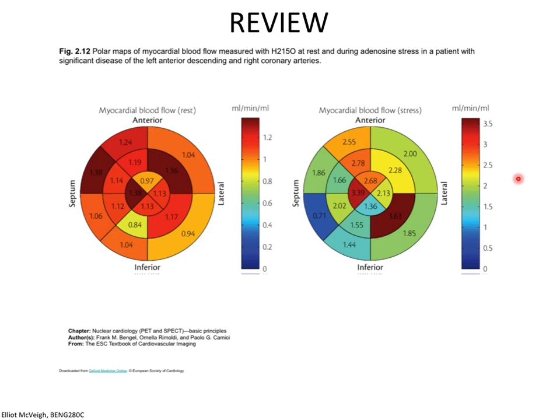One of the papers, or a number of the papers actually, that you guys could go and do a deep dive in, explains how you get this number. So you could explain it to the class. You could show us how the data is achieved, and then what mathematical modeling is done in order to derive these numbers, this quantitative blood flow. And people like me, like medical imaging physicists, go nuts for this stuff. We say, oh, we really want quantitative myocardial blood flow because I think we can measure it, is the truth, right? That's what actually happens.